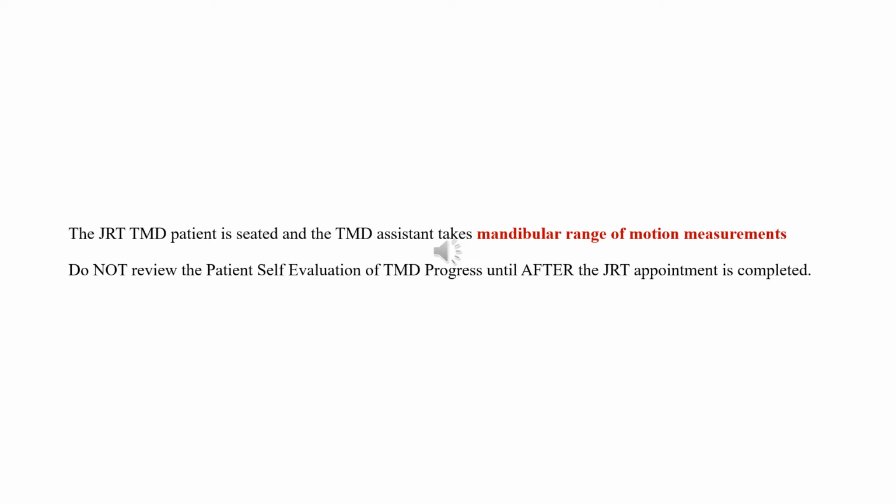So the JRT TMD patient is seated, and the TMD assistant takes mandibular range of motion measurements, right? You do mandibular range of motion measurements at every visit. Oh my God. People say, well, we have a person with a soft guard seated, but they're not a real TMD patient. Do I need to take mandibular range of motion measurements? Yes, we take mandibular range of motion measurements at every single visit.